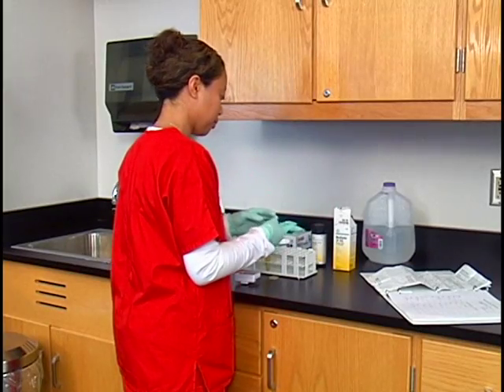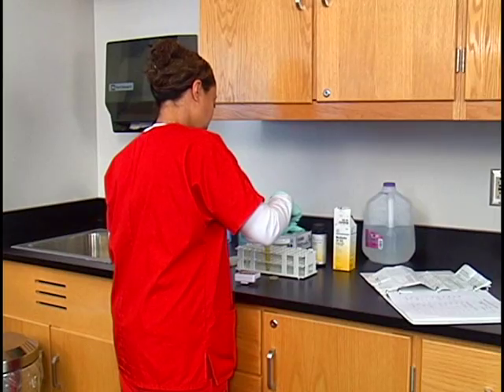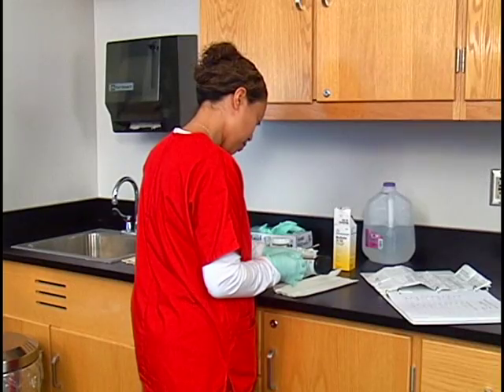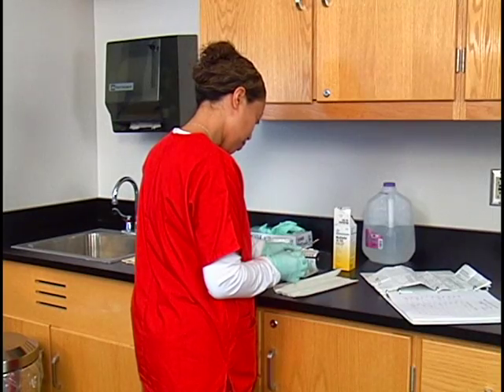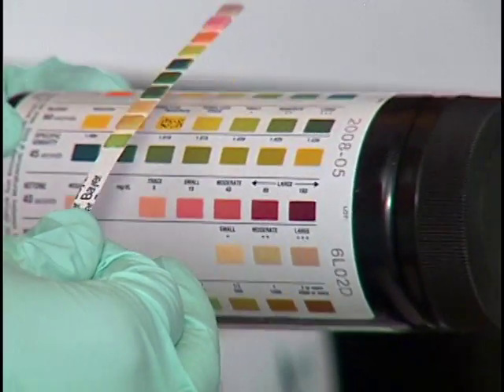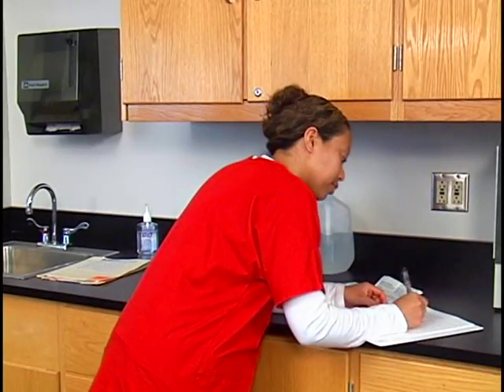Next, immerse a Multisticks reagent strip into the control solution. Start the timer and read the results at the proper reading times. Chart the control results in the quality control log sheet.